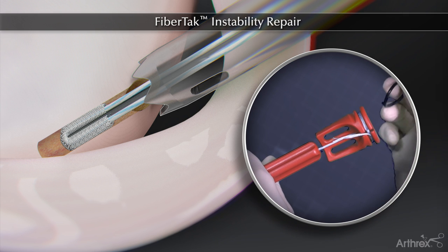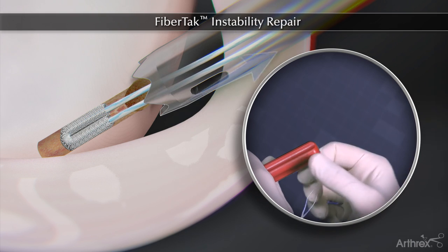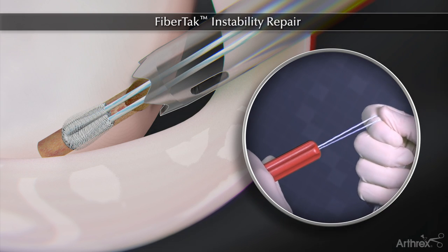The sutures are freed from the handle by removing the suture release tab. The handle is removed and the sutures are pulled to firmly set the anchor in the bone.